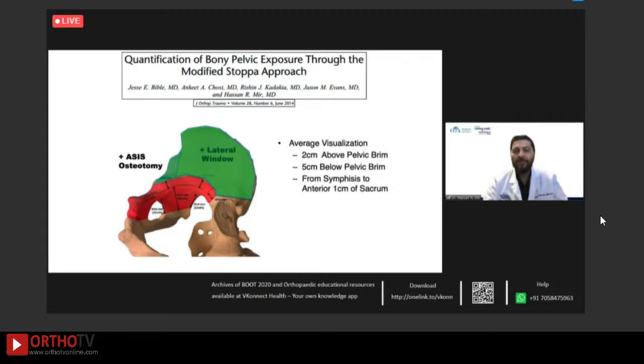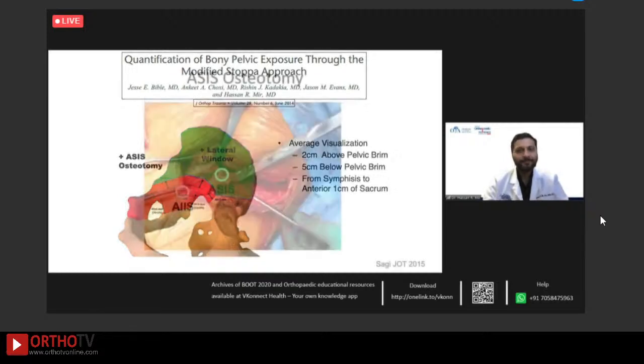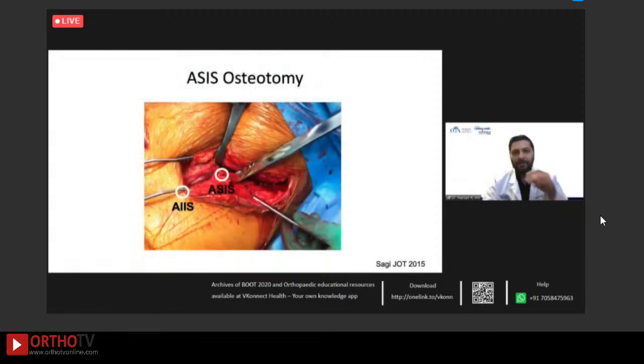And then, if you can't fix an ASIS osteotomy, you probably shouldn't be fixing the thing that requires the ASIS osteotomy, if that makes sense, right? So this has been described in the literature as well. Usually it's a step cut osteotomy between the ASIS and anterior inferior iliac spine. You do elevate on the lateral side of the ilium to get a good view.